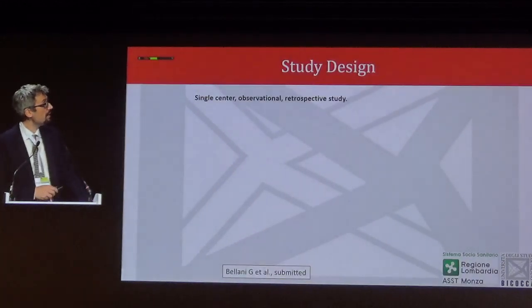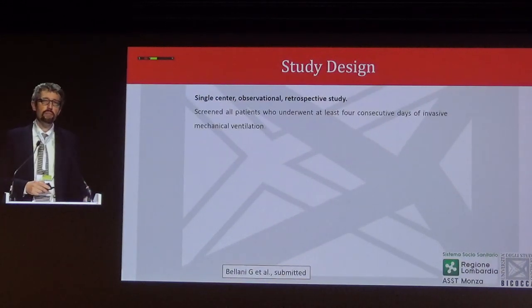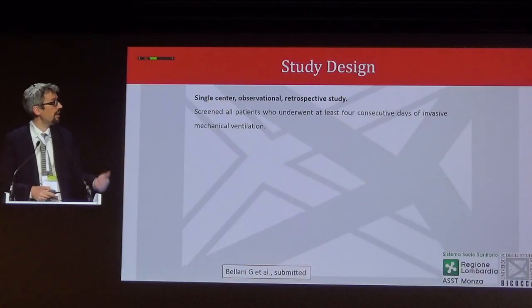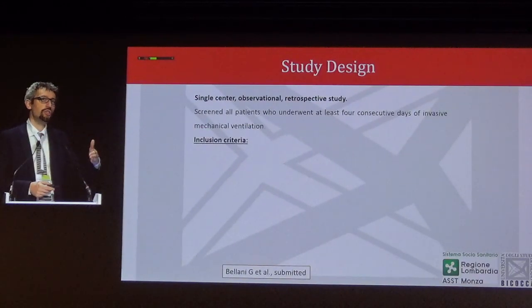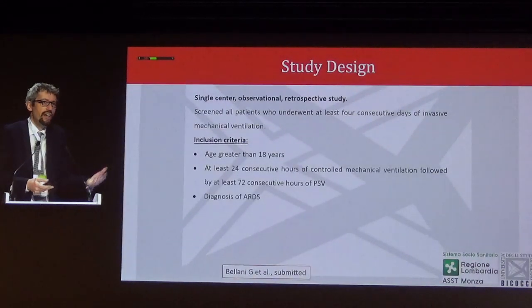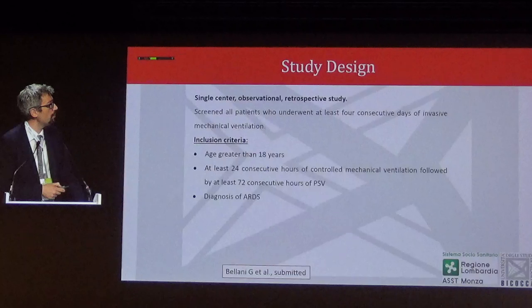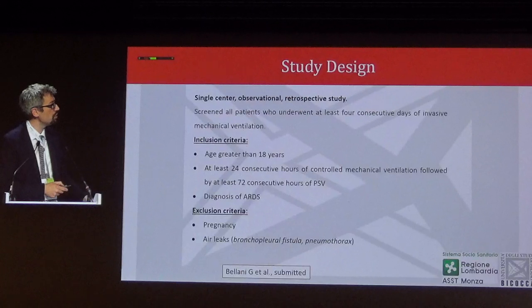So we set out a retrospective observational study. We could do it single center because it's not really a common measure, but in our ICU, doctors are used to that and they just write down the values in the chart every day. We screened all patients that after controlled ventilation were switched to assisted ventilation. It's not necessarily a weaning phase, it's just after the very acute phase, the onset of spontaneous activity, like we heard from Laurent, who had an ARDS, and some exclusion criteria that are quite standard, I would say.